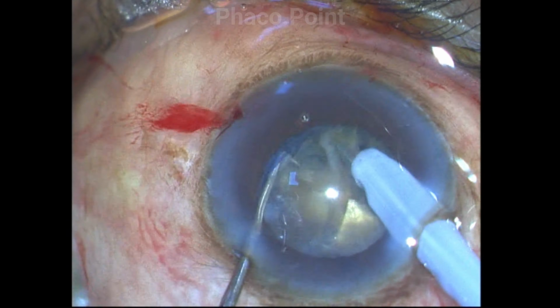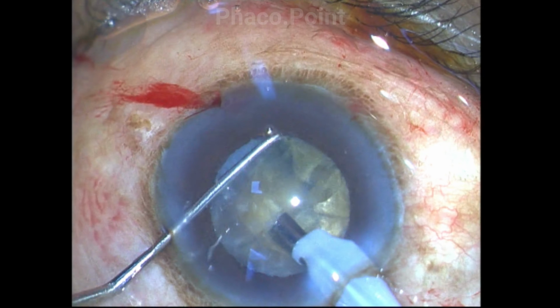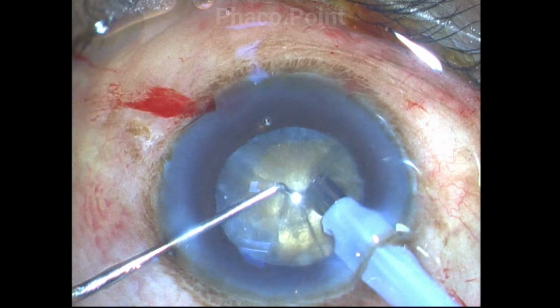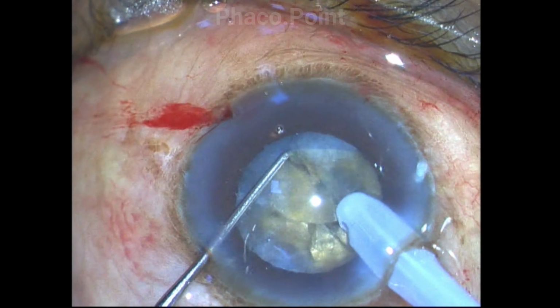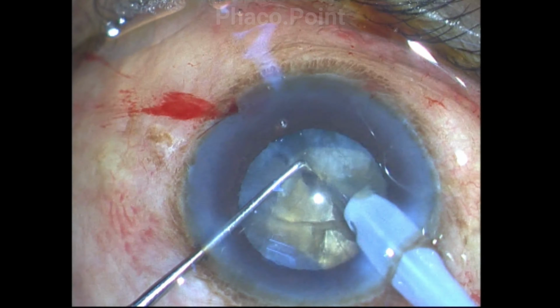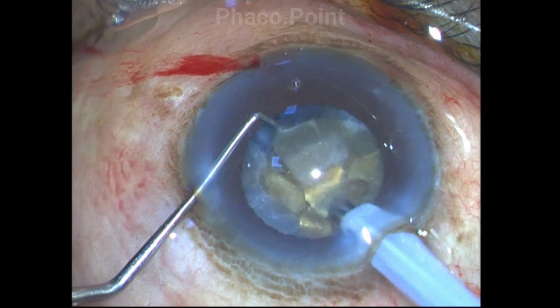Personally, I like to break the nucleus into all its fragments first before emulsifying each fragment turn by turn. And when I do so, I remove the sharp chopper and replace it with either a shorter chopper in case I need to further subdivide, or just a Sinskey hook, because it gives me a little more protection to the posterior capsule. With most of the fragments now created, we are now ready to emulsify the fragments individually.